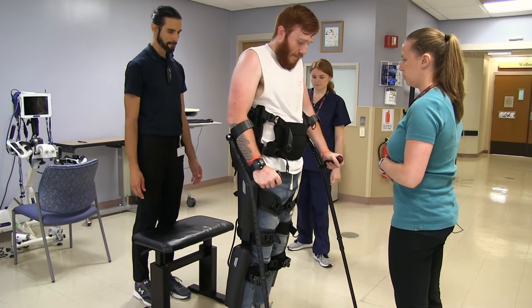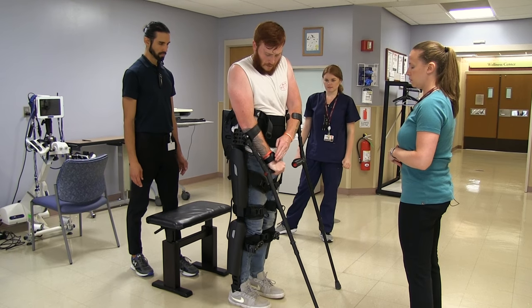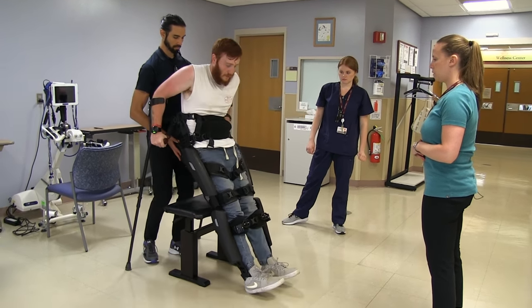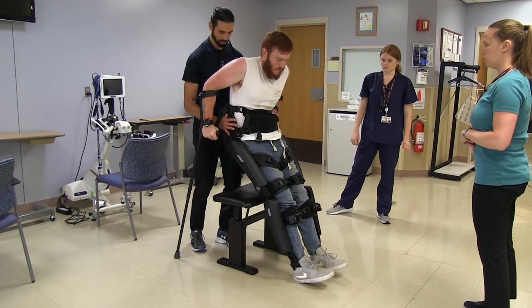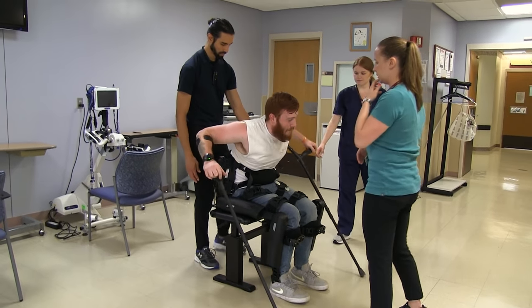Let's sit. The therapist instructs Keith to throw the crutches back and try to lean forward as the device goes down. That's it — nice.